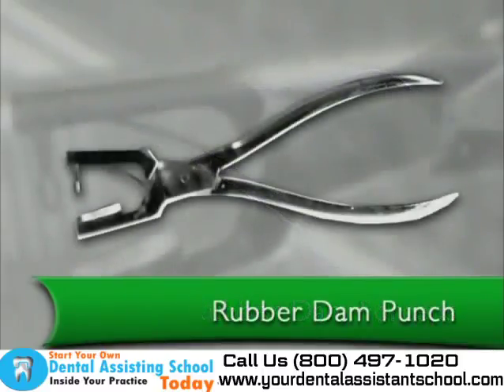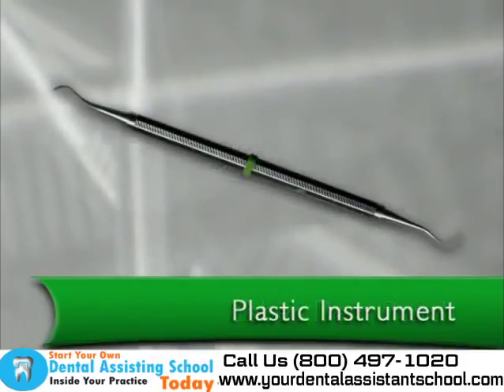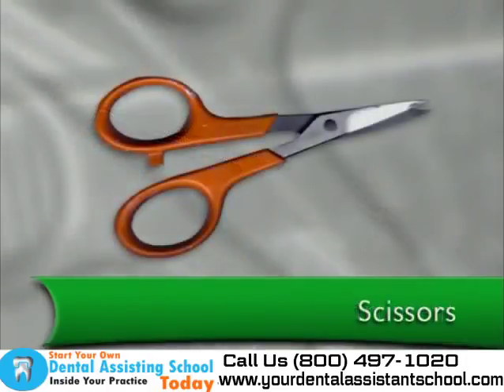A rubber dam punch for cutting the holes in the rubber dam material where the teeth will come through the material. A plastic instrument for tucking under the rubber dam's edges into the sulcus. And scissors for cutting the rubber dam material that is between the teeth when the procedure is complete.